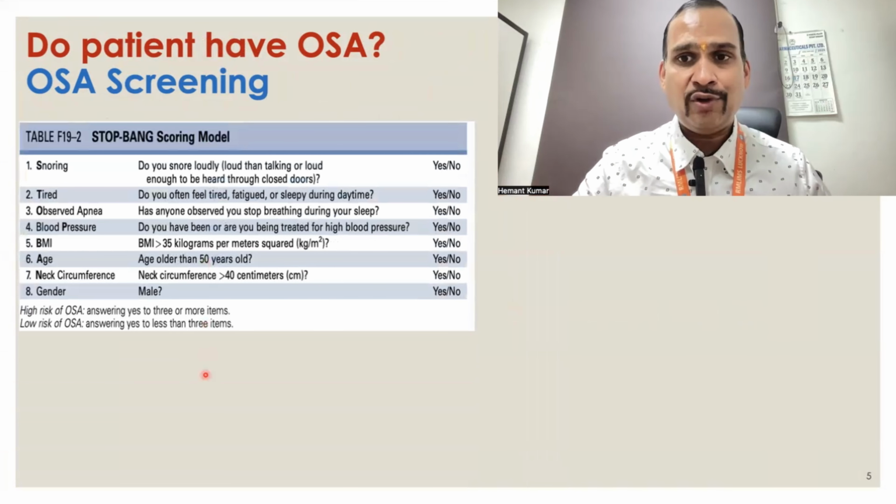If a patient had surgery and OSA was controlled, but after some time symptoms return, then we have to do polysomnography to diagnose whether his AHI has increased or not. If the patient is using oral appliances, in them we have to do a sleep study along with the oral appliances, so we can demonstrate whether the oral appliance is sufficient for him or not.